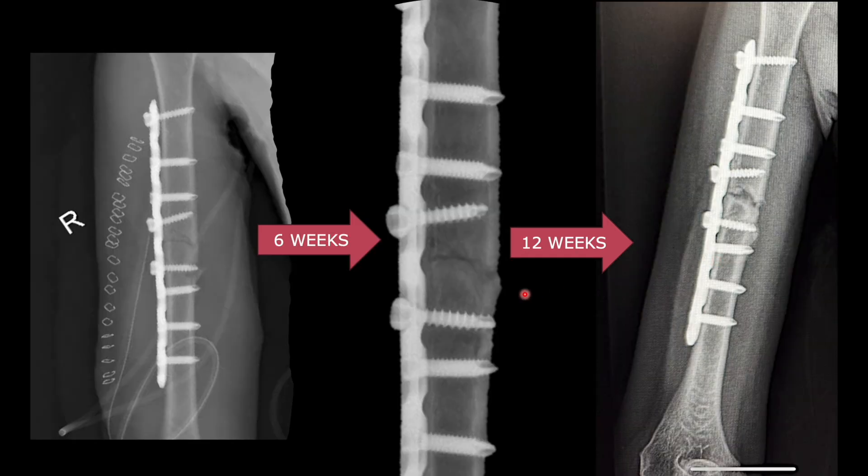Sclerosis is more evident at 12 weeks. This is the confusing stage — whether to wait or not. You should wait and check for signs of failure. If the initial reduction was perfect and you are seeing bone resorption and sclerosis, it is safe to wait for further healing. Also check signs of loosening: screw tips at the same level as the previous radiograph means no loosening. The healing process is proceeding toward remodeling.